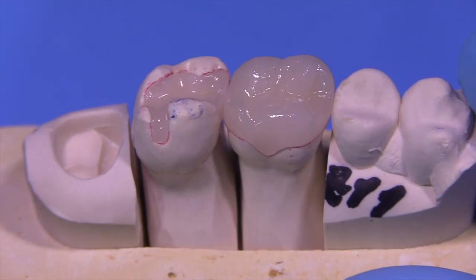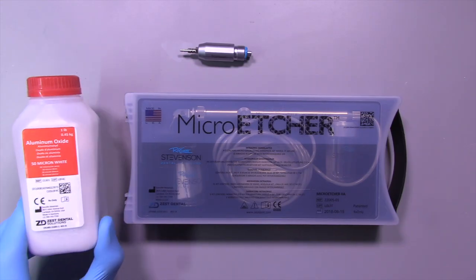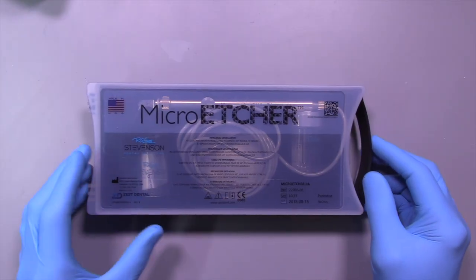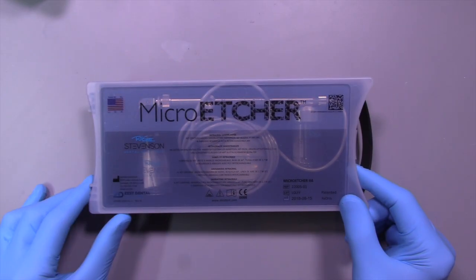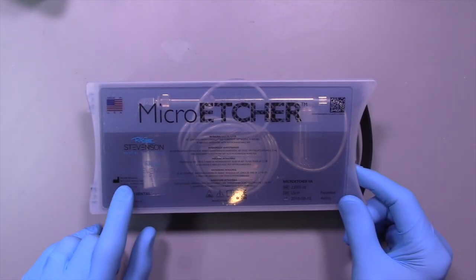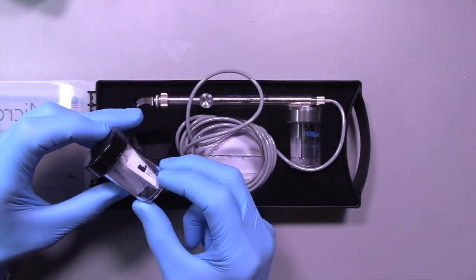Let's talk about some of the equipment you're going to need for this procedure. This is the micro etcher system that I use — it's called the Micro Etcher 2A. It's not that expensive. It's made by Zest Dental and distributed by Danville Materials here in California.